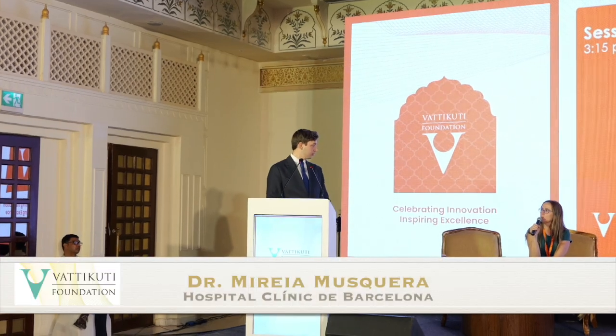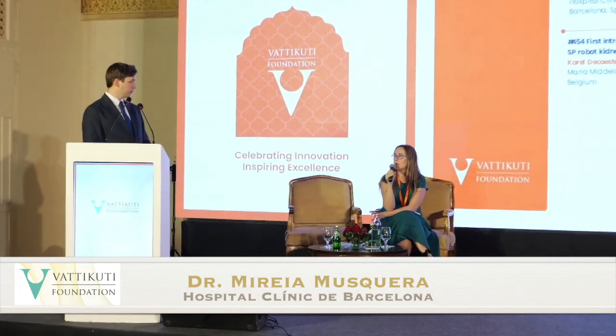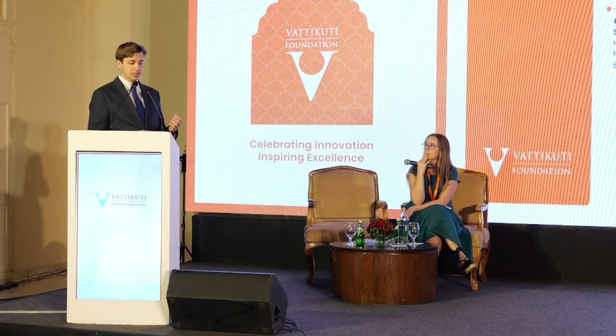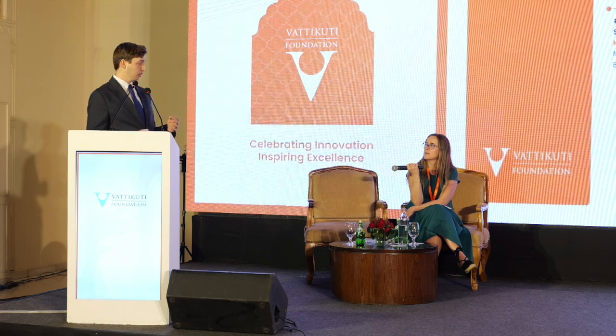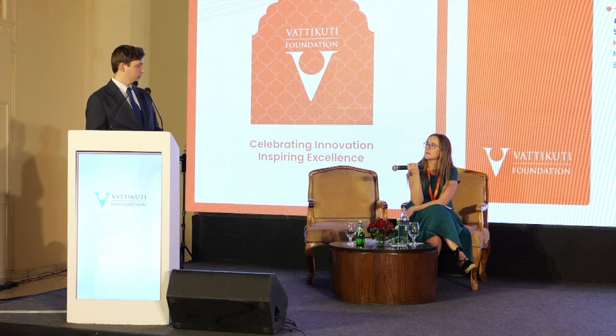So I would like to know which is the smallest size that you will allow to perform a robotic kidney transplant. In our center for pediatric robotic surgery, our limit is not based on age but on weight. So we use a weight limit of 10 kg. But in transplantation, Professor De Castaker only takes an age limit of 8 and a little higher weight also. So he prefers to have around 15 kg. And that's what the lowest was in our center.